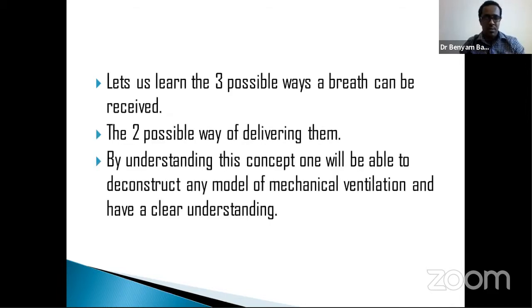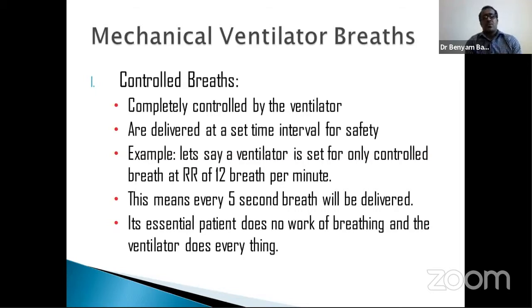So in general, there are three possible ways breaths can be delivered to the patient by the mechanical ventilator, and there are two possible ways of triggering those breaths. By understanding these two concepts, you'll be able to deconstruct any model of mechanical ventilator and have a clear understanding, because all models of mechanical ventilators work in this approach.